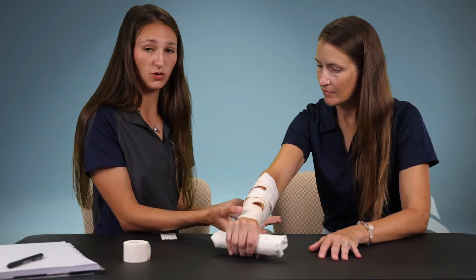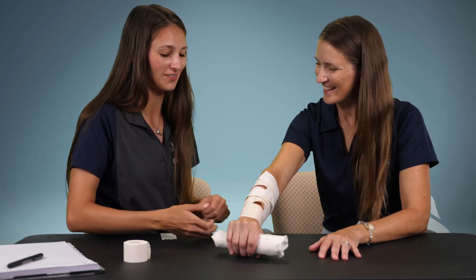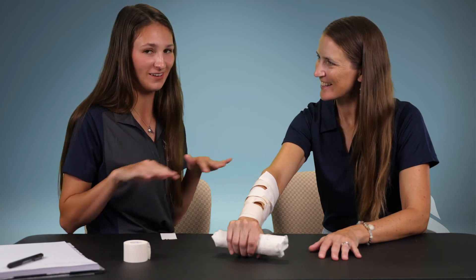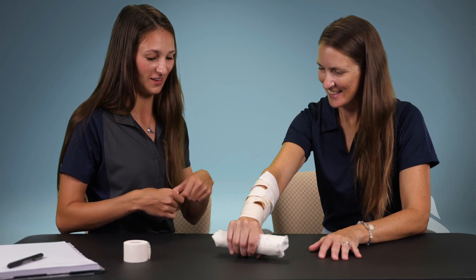This isn't the prettiest splint, but it will make them more comfortable. If we're doing the arm, we'd usually put them in a sling — I'm sure most everyone has seen a sling; if not, you can google it. This is just one of the many things athletic trainers learn in trauma, and there's so much more — injury prevention, wellness, health administration, and all the other domains we go through. So this is just a little tidbit about athletic training.